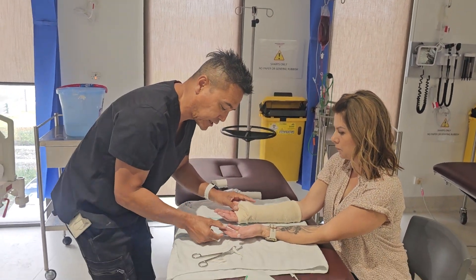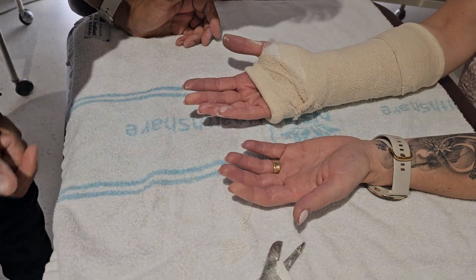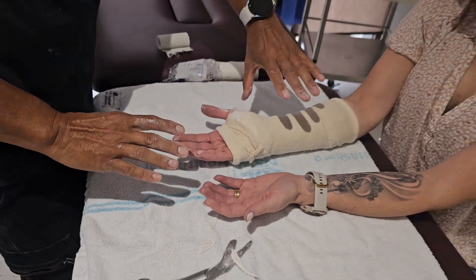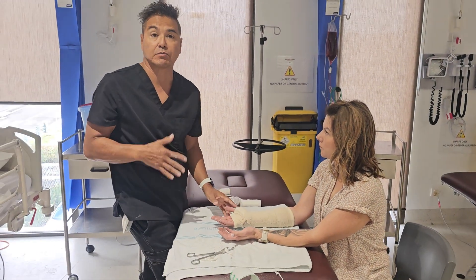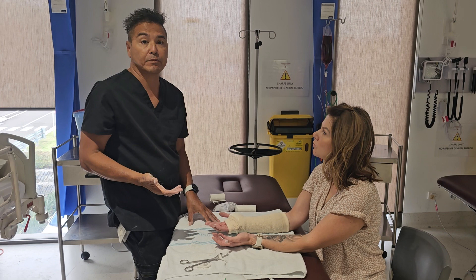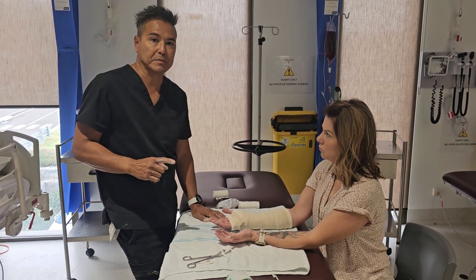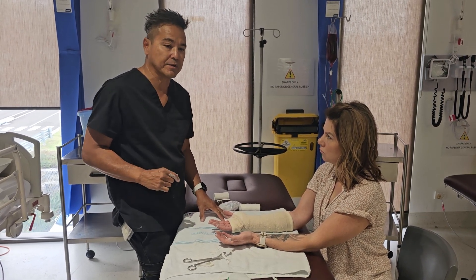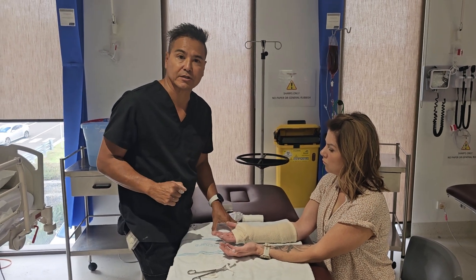Once that's done, I give the patient's hand a clean and do my final circulation observations — one one-thousand, two one-thousand, three one-thousand — actually a little bit better on this side. Post-procedure, we need to elevate the arm as much as possible and then apply a sling. I'll do a separate video on how to apply a sling, as the fracture clinic approach is a little different from many first aid courses.